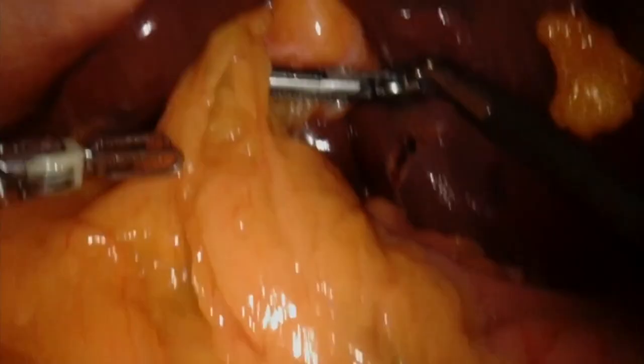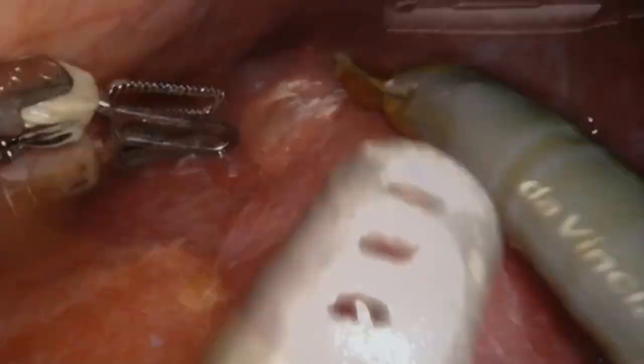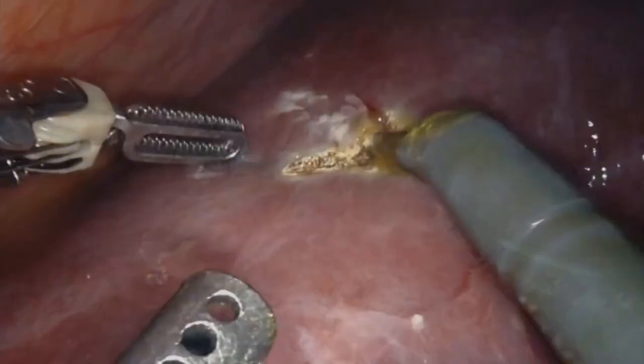As we can see here, the liver is elevated cephalad. The adhesions to the falciform ligament were taken down with hook cautery as well. A small subcapsular lesion was biopsied with energized scissors.